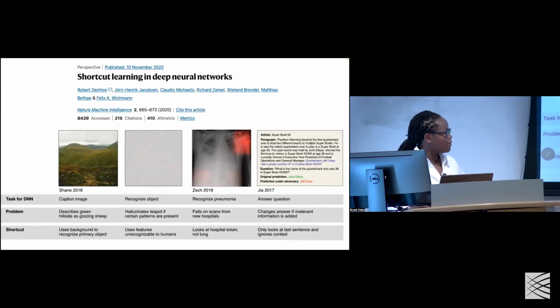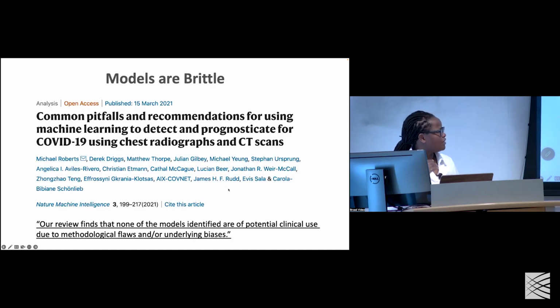We discussed a little bit about shortcut learning. And this is important to understand. We've known that location matters a lot for chest X-rays. This has been repeated many, many times. This is a great paper that looked at why all the COVID models couldn't work. They learn from where the patient is. And until we understand the so what, we don't really know the significance of the hidden signals in terms of understanding the role of confounders.